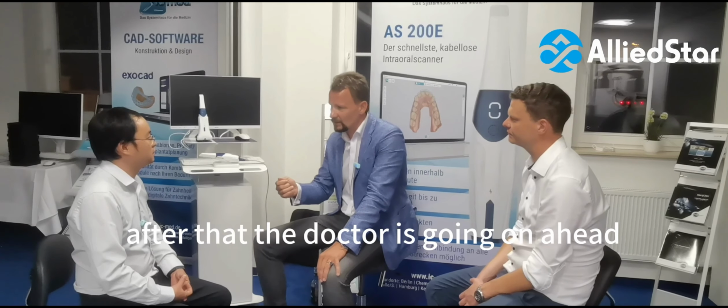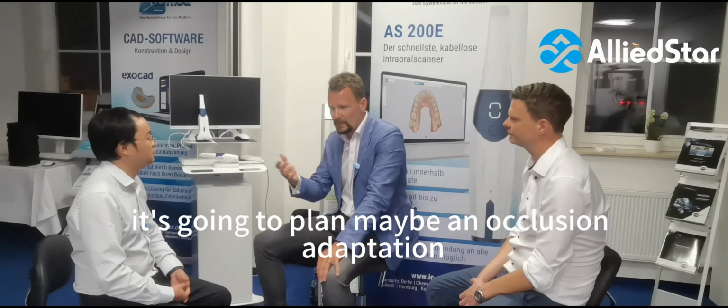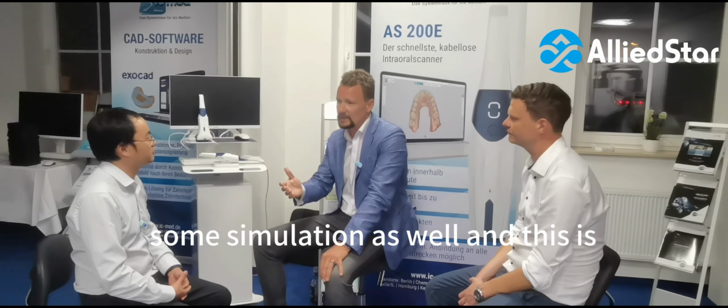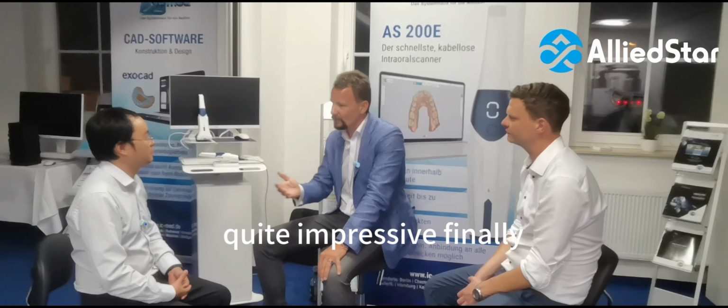This is done by the assistant. After that, the doctor goes ahead and plans maybe an occlusion adaptation, a crown, something like that. There's also some simulation as well. And this is quite impressive, finally.